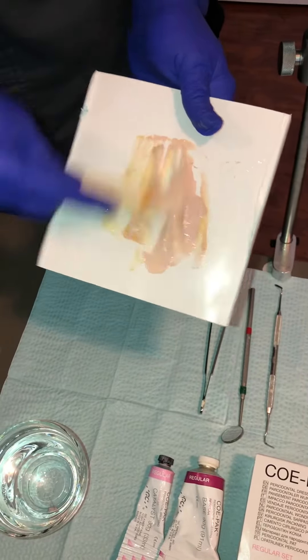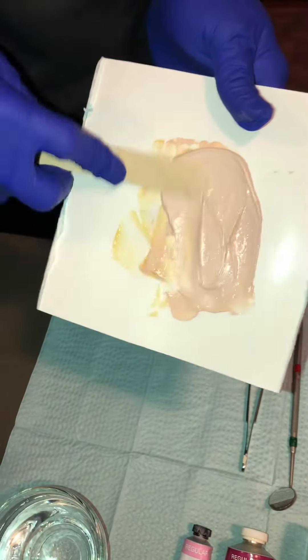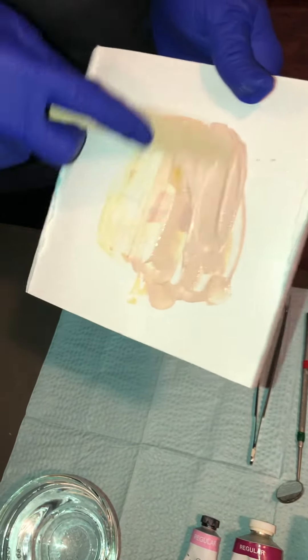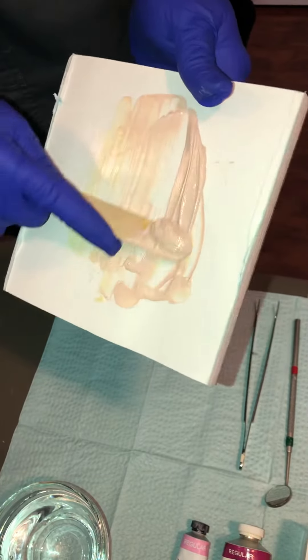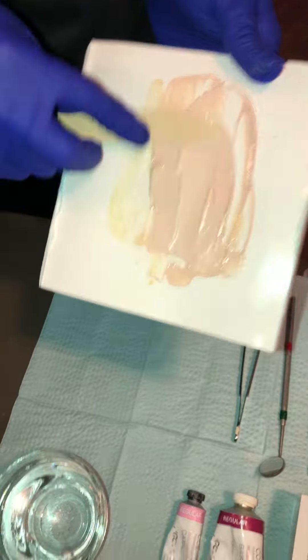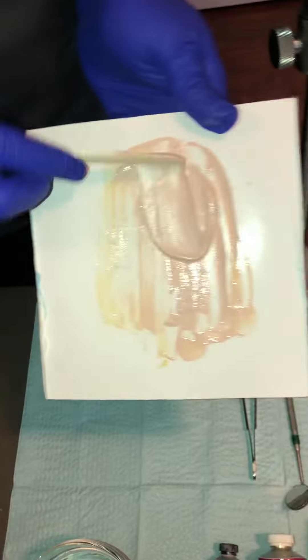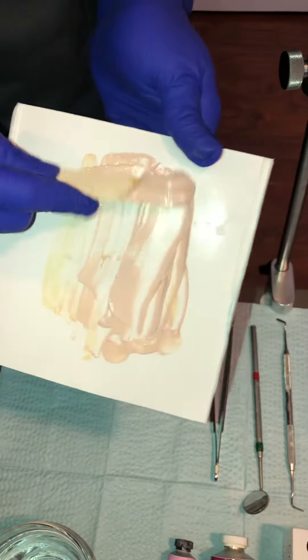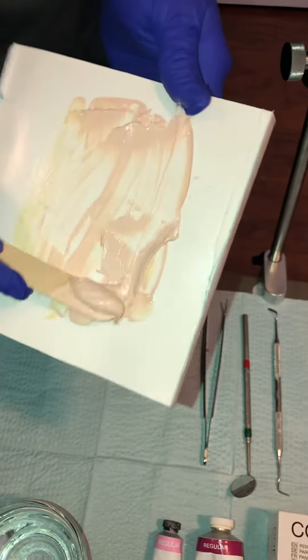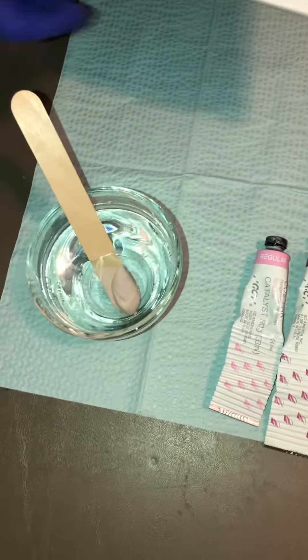Just make sure you mix it all the way — you don't want any streaks in the mix. Scrape it all up. It takes a little bit to set, so I grabbed a bowl of water, and that will help accelerate the set. So just mix, mix, mix, and then as it's all mixed up, gather as much as you can onto the tongue blade, and put it right in the water to set.